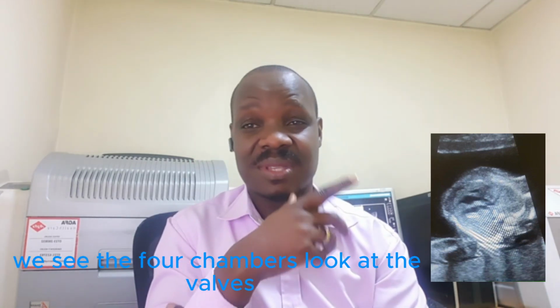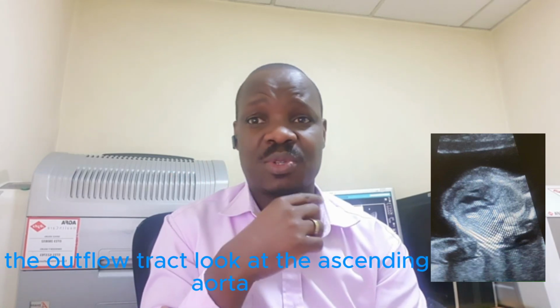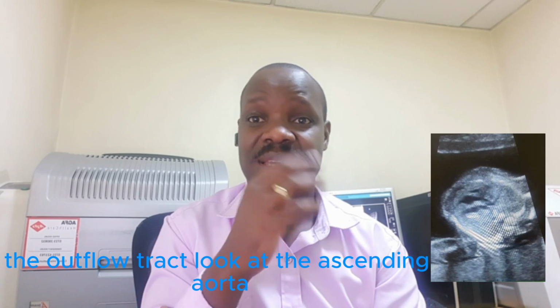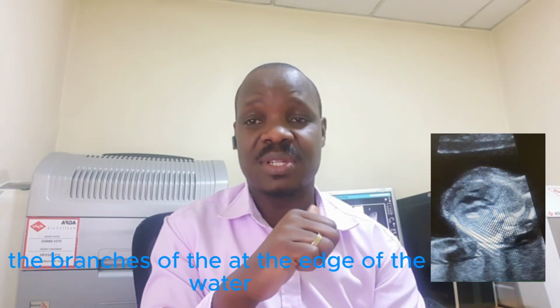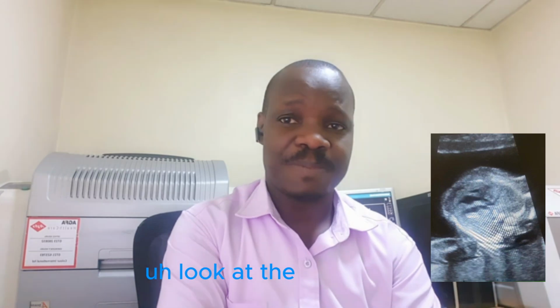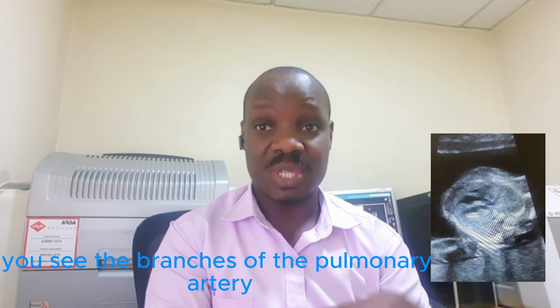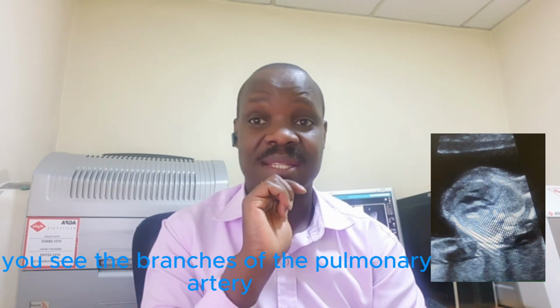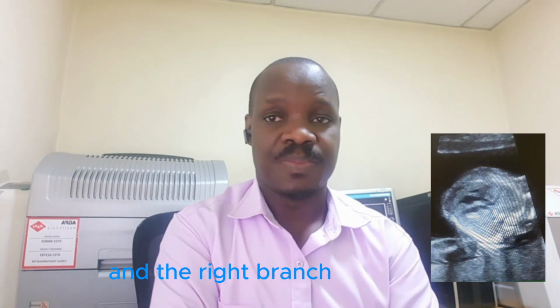Look at the valves, look at the mitral valve, the tricuspid valve, the aortic valve. Make sure you look at the outflow tract, look at the ascending aorta, look at the arch of the aorta, the branches of the arch of the aorta. Look at the pulmonary artery. Make sure you see the branches of the pulmonary artery, the left branch and the right branch.